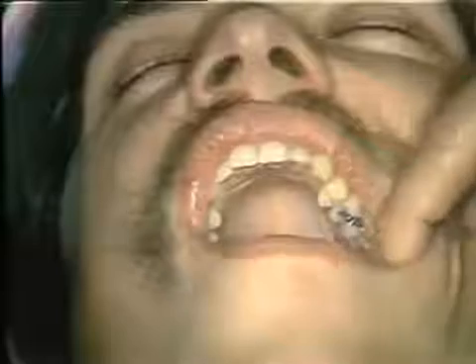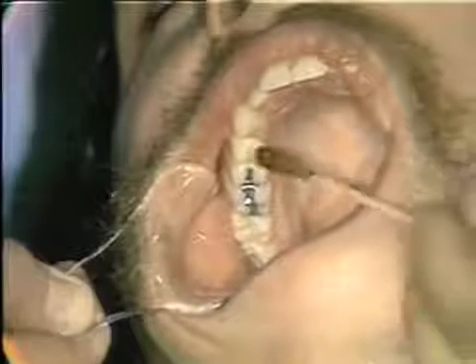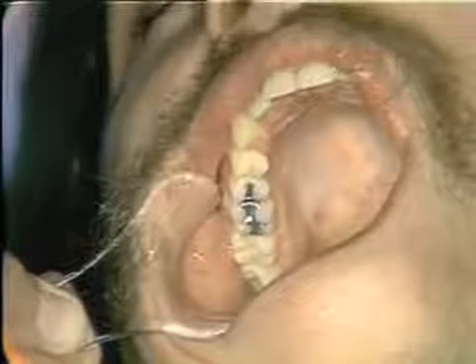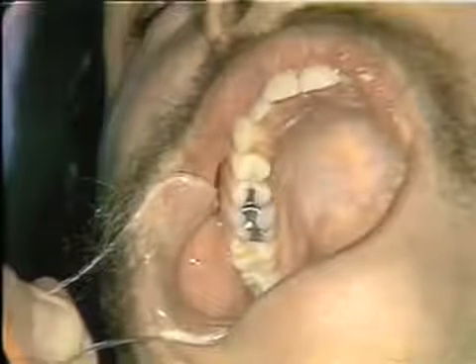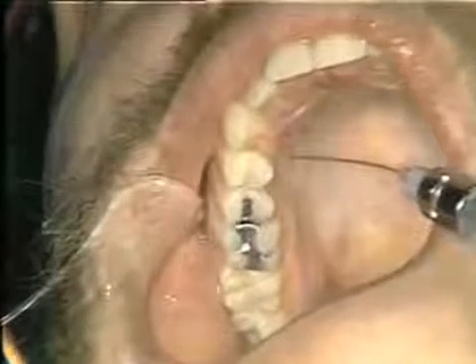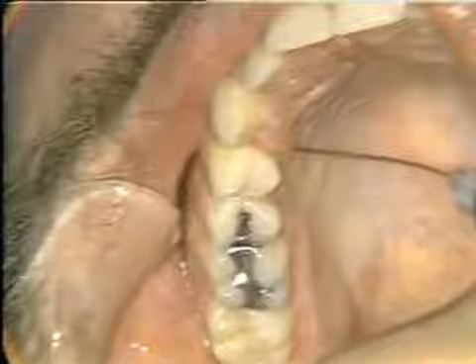Let us suppose we were going to remove the maxillary first bicuspid. I'll let you slip your retractor in there again, please. And you might turn away from me just a little bit. That's fine. We dry the mucosa, just resting it there for a moment. And then a little tincture of betadine right in the area of the injection, just palatal to the first bicuspid. And then our puncture is made about a centimeter out from the free gingival margin on the palatal surface, in approximately that position. And again, needle bevel carried to bone, and then we aspirate.